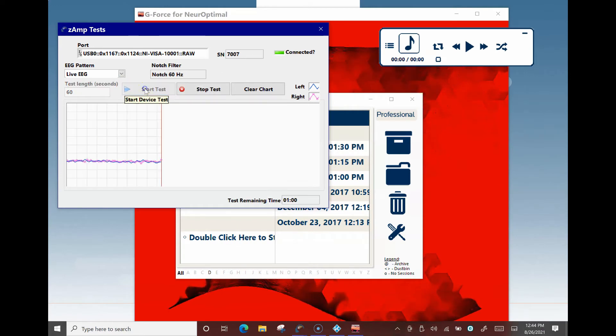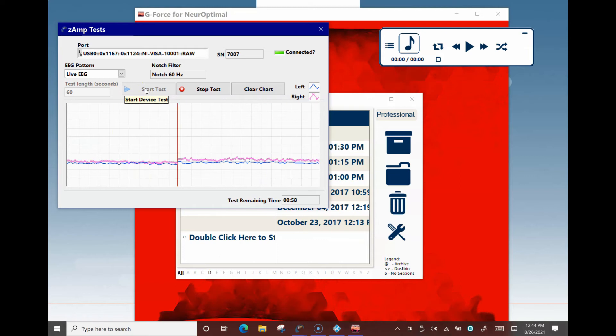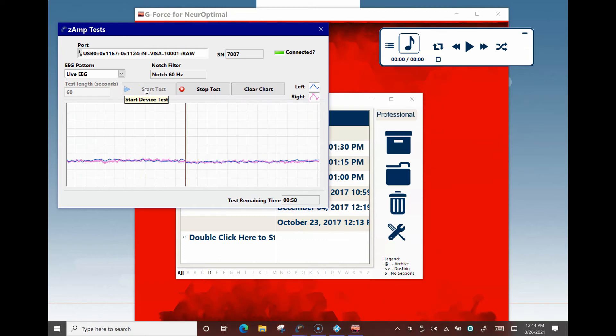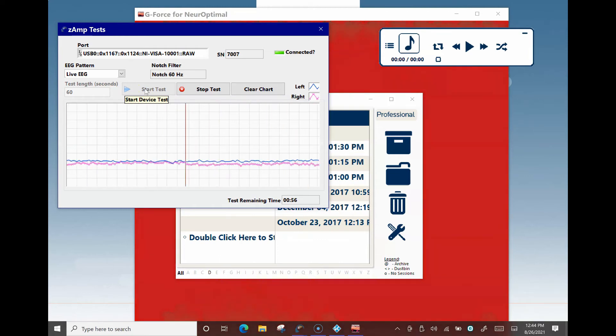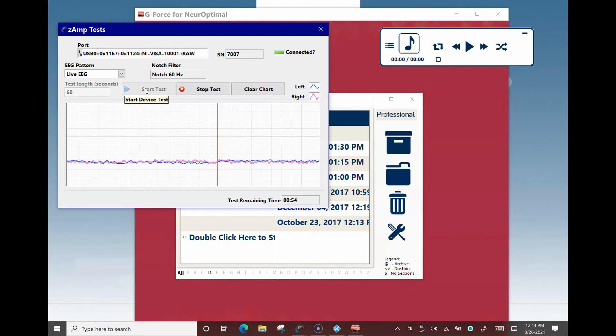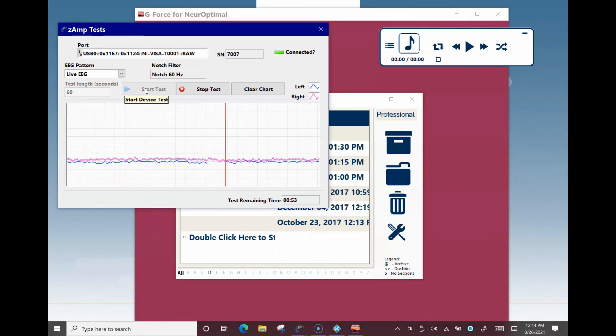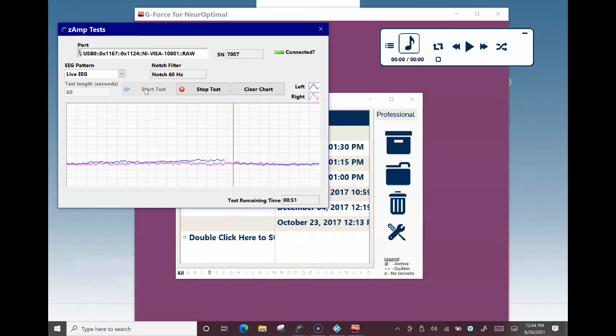The left or blue and right or pink lines should follow each other closely. This indicates that the sensors zero out and are reading signal properly.